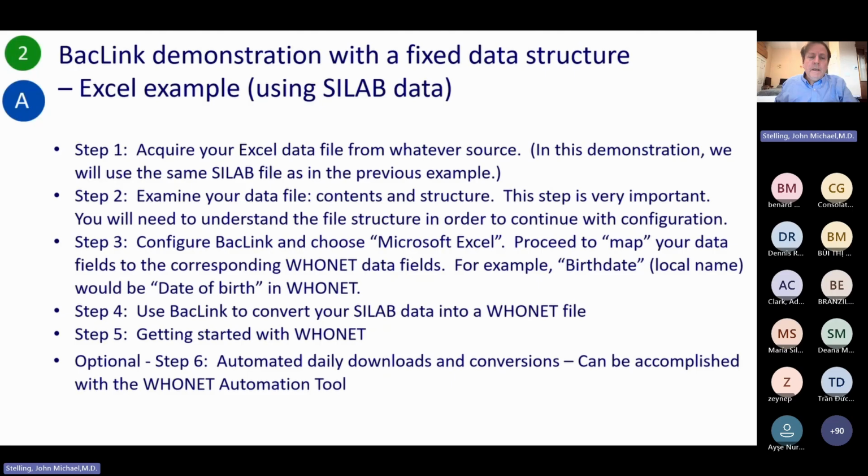We cannot export from your system. I don't know your system. We don't have the passwords. We don't have the security access. But your IT people hopefully know how to schedule an export. In my own hospital, it's automatic daily. Other places, they do weekly or monthly.